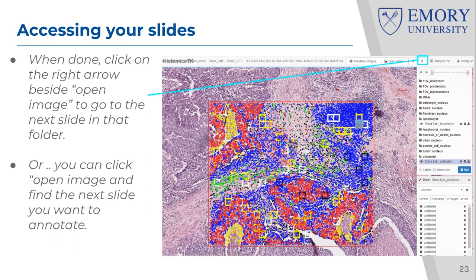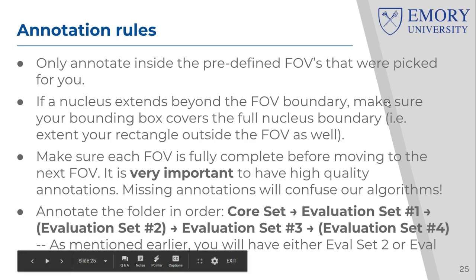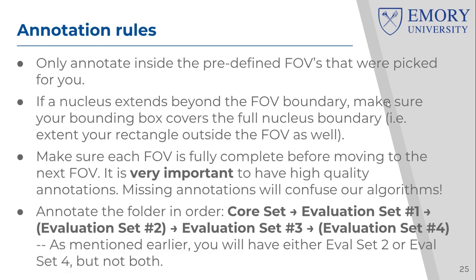That is really going to be detrimental and going to degrade the quality, and it's going to be hard for you to know when you finish the field of view. So what you really want to do is go through one field of view at a time. Make sure it's finished completely and you're comfortable with it. Then go on to the next one. Okay. And again, it's very important that you do that.